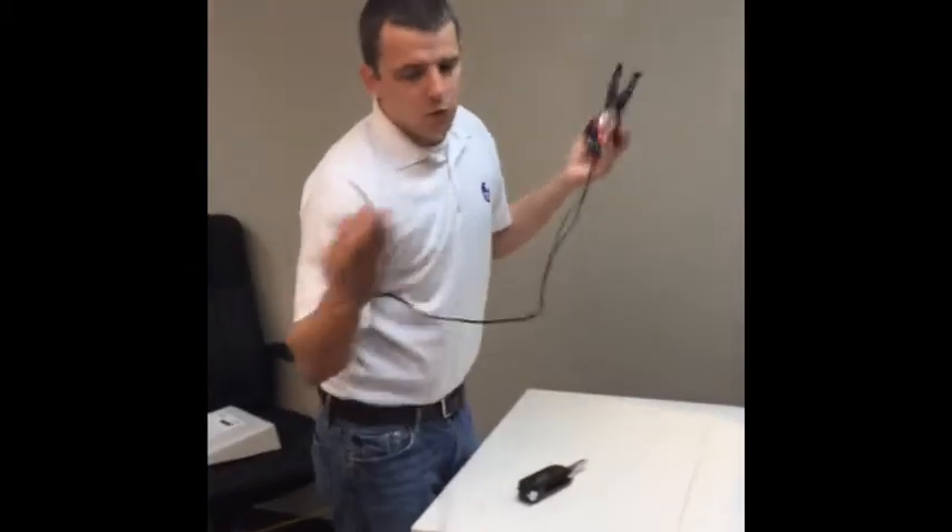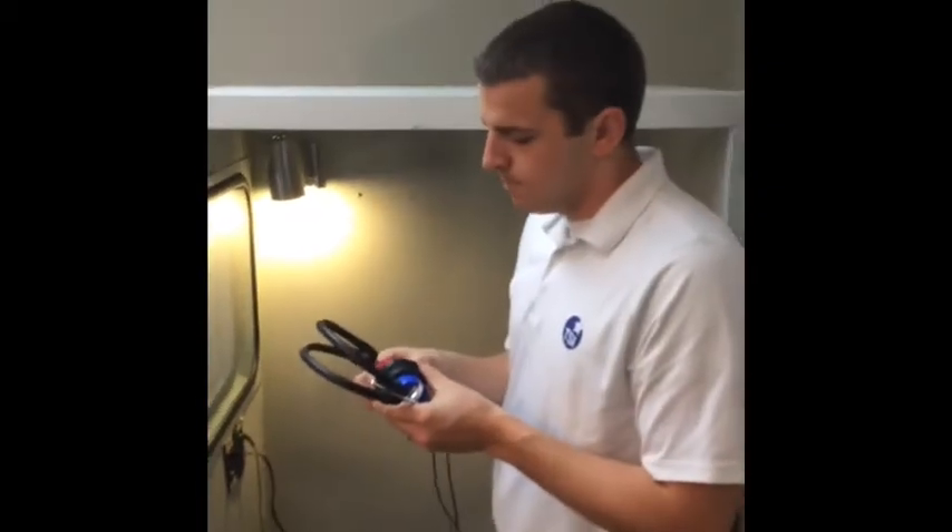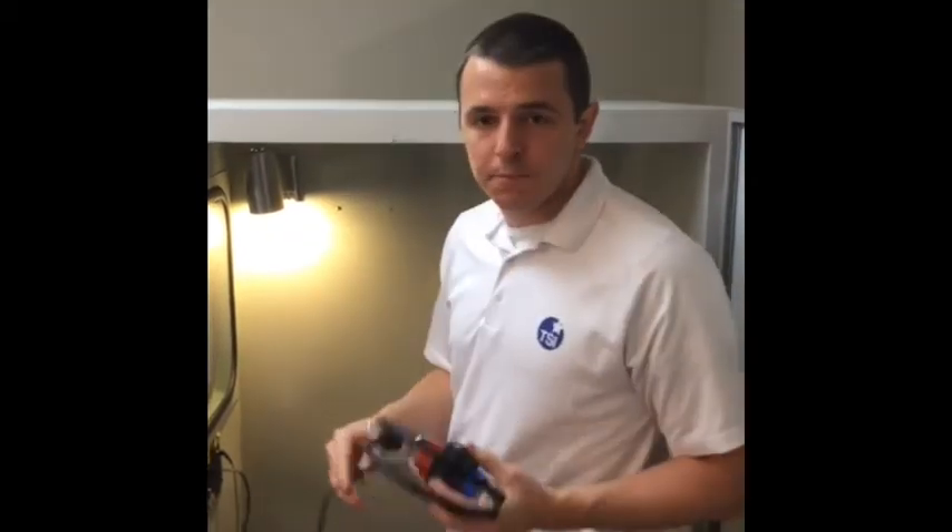Now just take this new cord, go around to your booth, put it in the jack, and do a listening check. Everything should work out fine. That's how you replace an audiometer headphone cord.